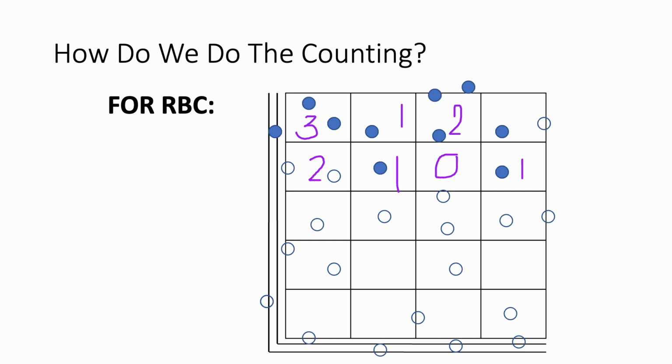Teka, sorry ha. I forgot to notice. Okay, wait lang. I have a mistake. Okay, clarify ko lang ha. 'Di ba kanina ito guys, hindi natin to kinount kasi nga dapat dito na siya i-count. So dito hindi yan 0 pala, 1 yan. Okay? Kasi itong cell na to, you counted it together dito sa square na ito.